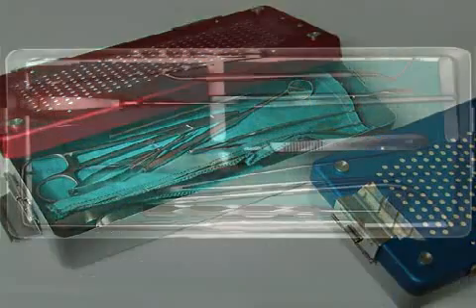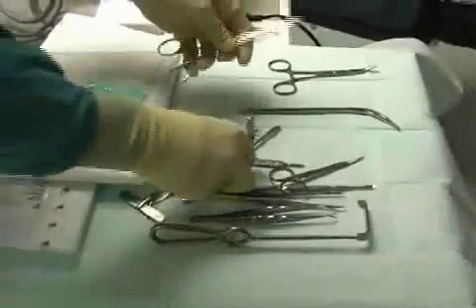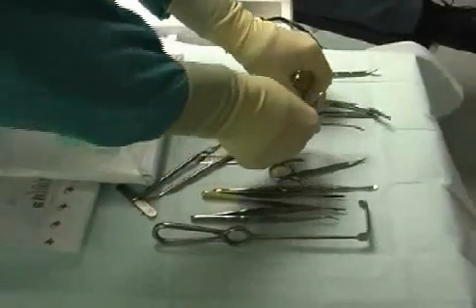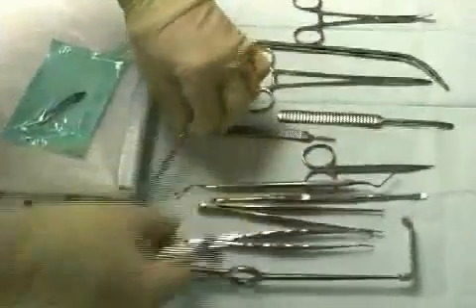Here you see a surgery container. The surgical instruments are neatly placed next to one another and ideally stored for the sterilization process. Prior to surgery, the container is opened and the surgical instruments can be removed with sterile gloves. The sterility chain remains intact.